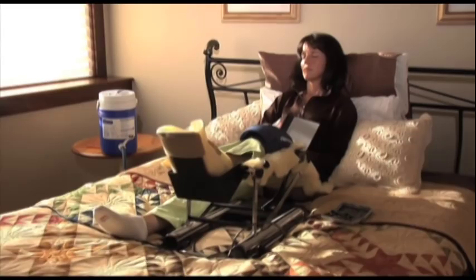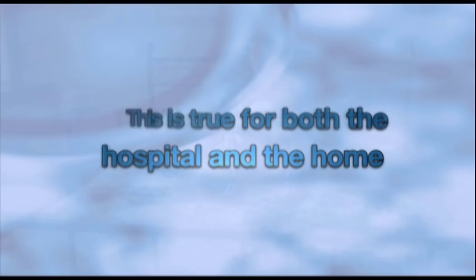Over the past 20 years, the MedCom group has developed several pearls in order for patients and clinicians to get the maximum benefit from CPM therapy. We'd like to share them with you. We have found that patients who use the CPM machine at night while sleeping wake up with greater mobility and have a more restful night. This is true both in the hospital as well as in the home. So keep in mind that flexion may be reduced at night to assist with restful sleep. Studies have shown that 40 to 50 degrees of flexion will maximize the edema reducing benefits of CPM therapy.